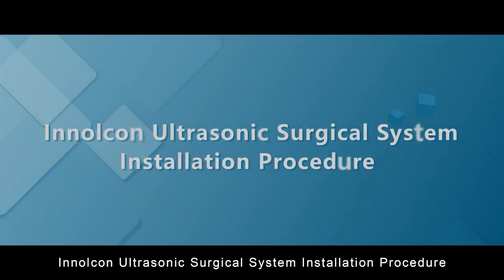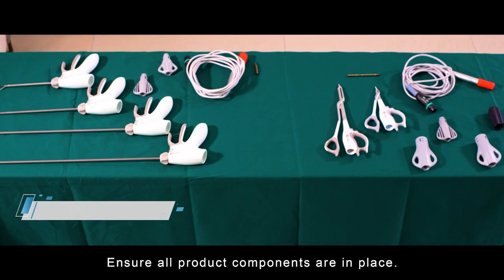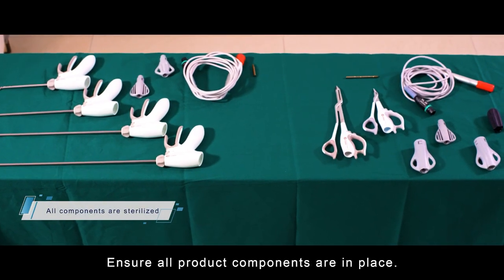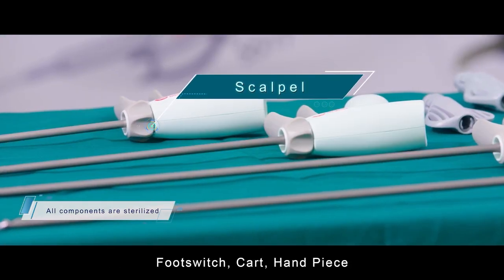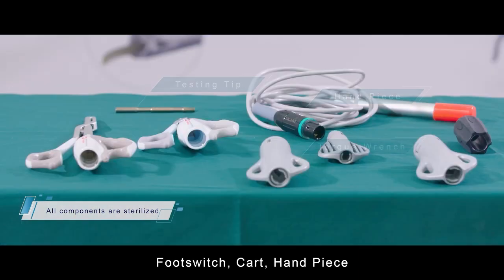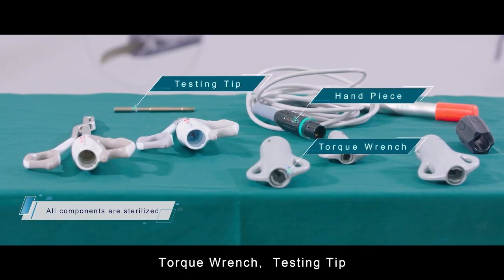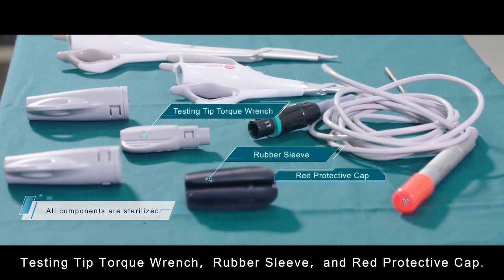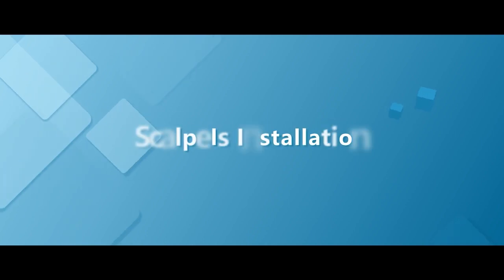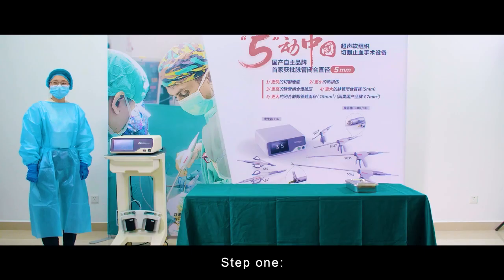Innolcon Ultrasonic Surgical System Installation Procedure. Ensure all product components are in place. The components include generator, scalpel, foot switch, cart, handpiece, torque wrench, testing tip torque wrench, rubber sleeve and red protective cap. Scalpel's installation. Step 1.